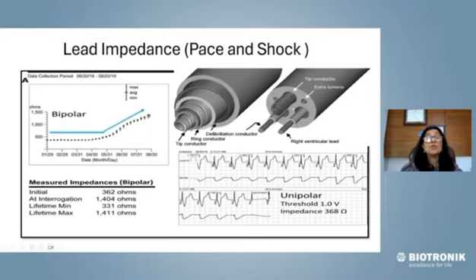They are well insulated. So remember, these leads can fail. They can fail because they're subjected to continuous trauma by the contraction of the heart. They can fail if, during lead implantation, the lead is within the subclavian crush. There are many things that can happen to an ICD lead. So whenever you're checking an ICD lead, keep it in your mind. The ICD lead is complex. I should be careful with the lead impedance. The lead impedance, if high or low, raise an alarm.